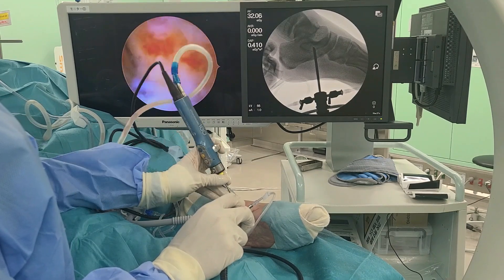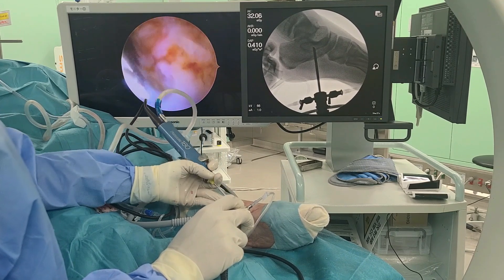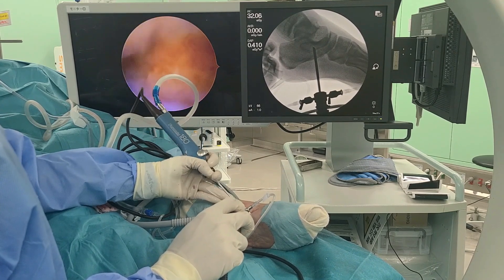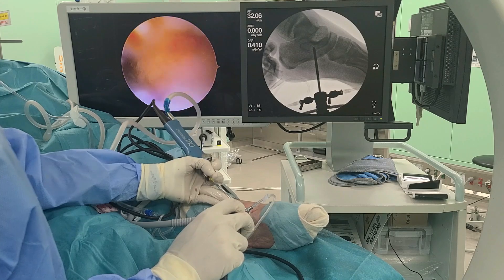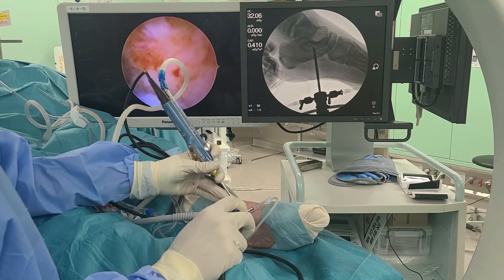The debris was cleaned using endoscopic saline. We do not perform posterior tibialis tendon reattachment because the space remaining after bone resection is filled with tendon-like tissue by the time of follow-up MRIs at one year.